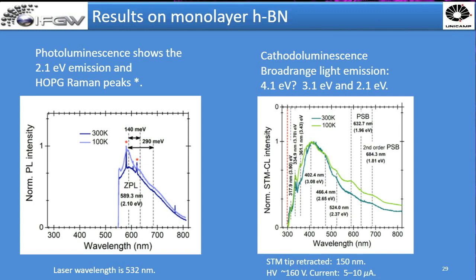And here's another question about the light collection efficiency. You said that your device has about 70% collection efficiency. How was that efficiency determined? So there are basically two ways that we can determine that. It's not something that is easy, indeed.